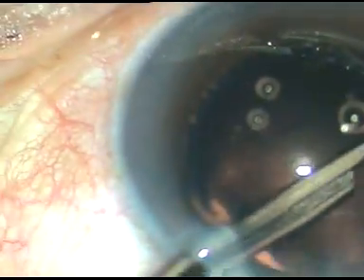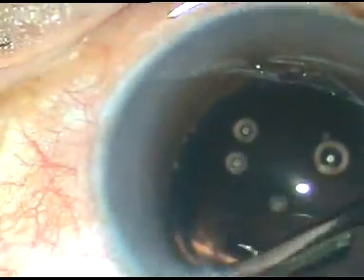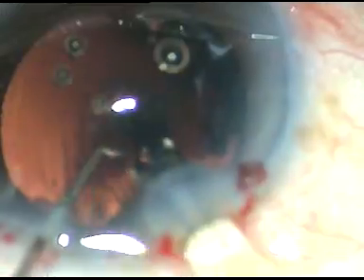We must not spend a lot of time inside the eye. The phacoemulsification part in grade 3 cataract should be over in 2 minutes, and the other steps should take about 6 to 7 minutes, so in 10 minutes your surgery should be over. Beginner surgeons can take a little longer — say about 15 minutes — but if you spend too much time inside the eye, you are going to damage the corneal endothelium.